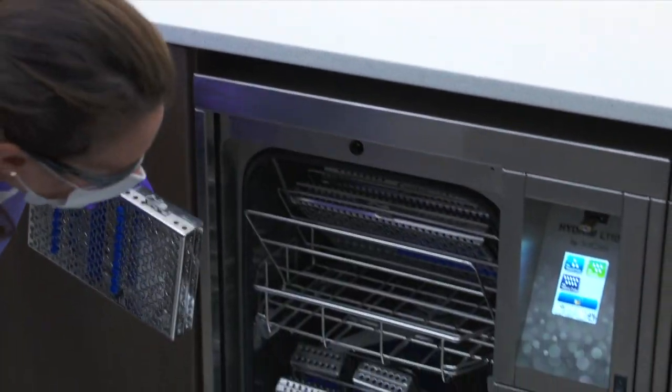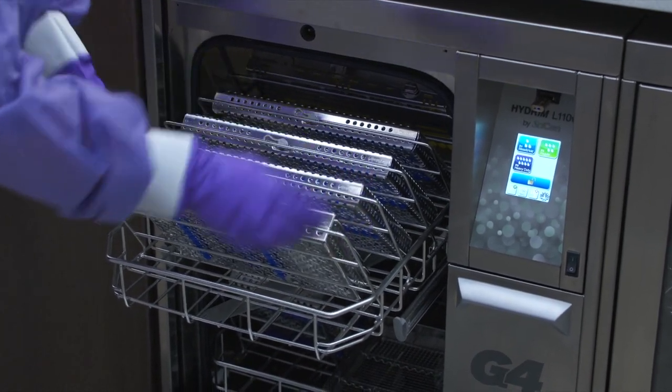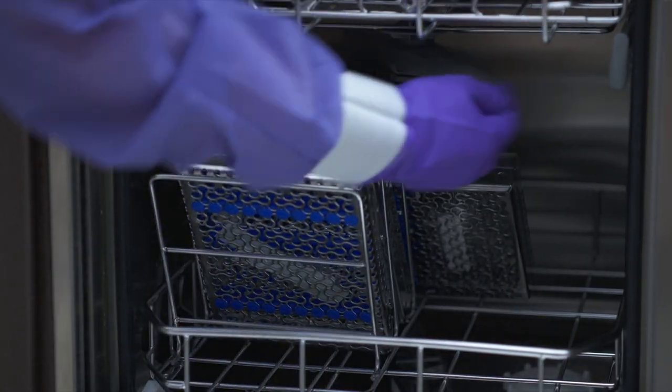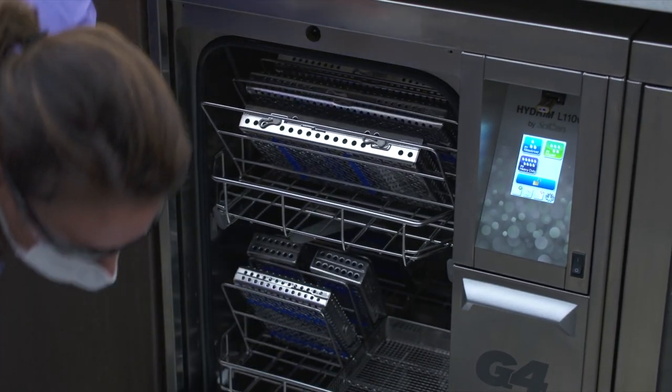Place trays and other concave-shaped items at an angle to ensure water can run off surfaces easily. Never place cassettes flat in the loose instruments area. When placing cassettes in the Hydrum, make sure that they do not block the wash arms. Once the Hydrum is loaded with instruments, you can close the door.